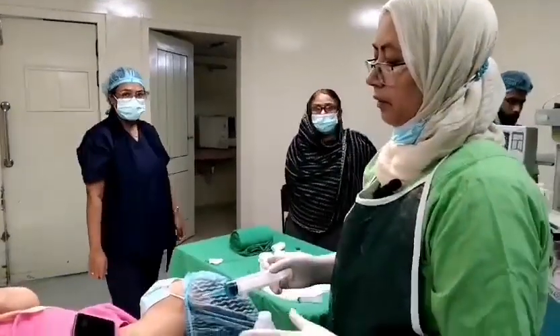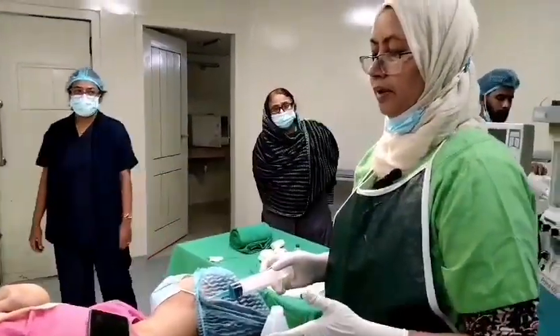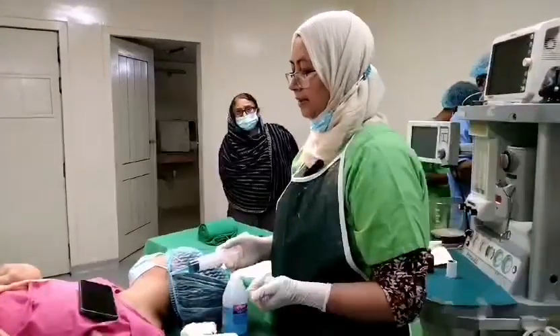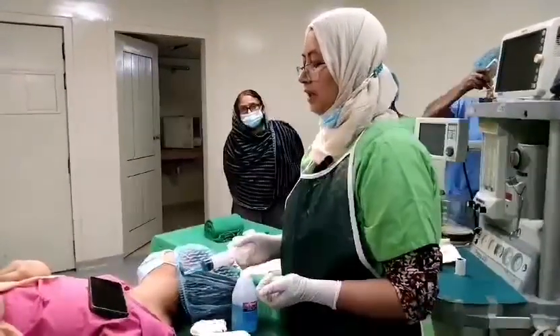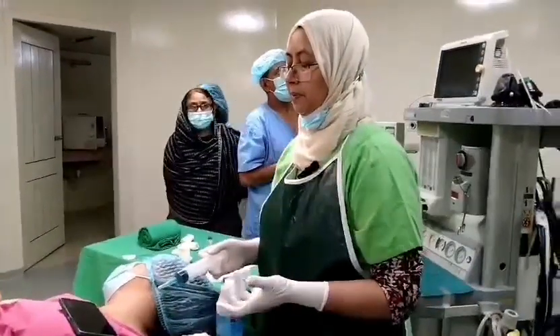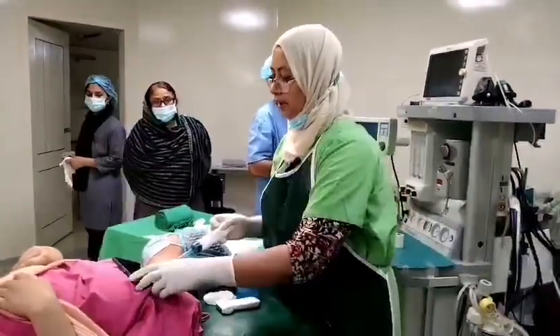Assalamu alaikum. We are going to do an ultrasound-guided FNAC of a supraclavicular lymph node. This patient is a breast cancer patient who was under treatment, but now she has a left supraclavicular lymph node palpable. So we are going to do this procedure.